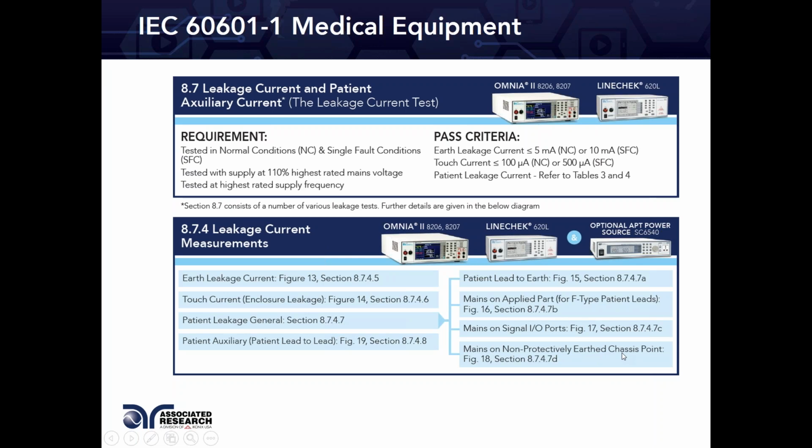So imagine having a metal point on your product that's not grounded, but it could be capacitive coupled and get energized and create some additional leakage to earth. If you apply voltage to this point, can additional leakage be felt by a patient that's connected to one of your applied part? And then you have figure 19 here on the left that shows you information about patient auxiliary.